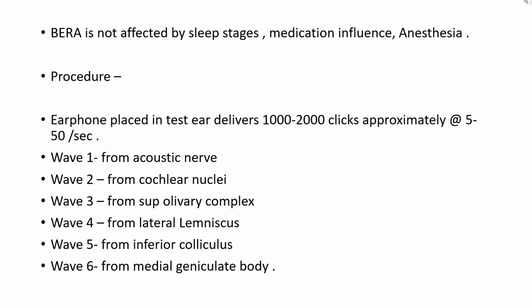Wave 1 will be originated from the acoustic nerve. Wave 2 will be originated from the cochlear nucleus. Wave 3 will be originated from the superior olivary complex. Wave 4 from the lateral lemniscus. Wave 5 from the inferior colliculus, and wave 6 from the medial geniculate body.